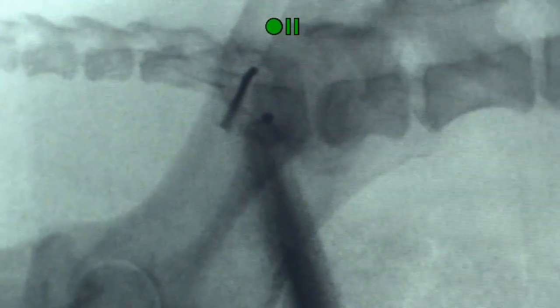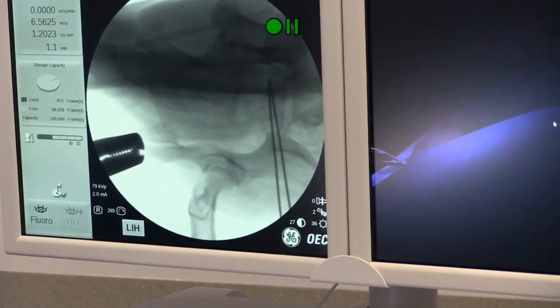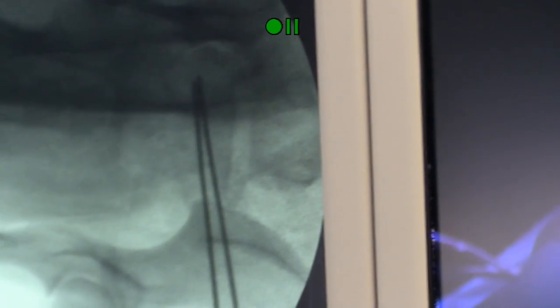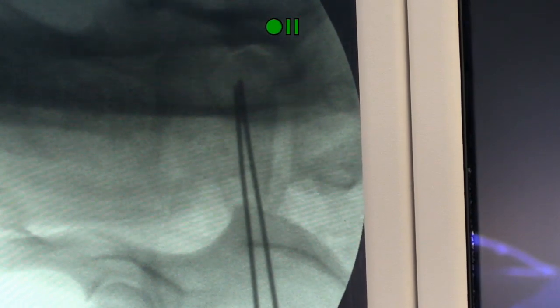So we'll do the orthogonal view now and check to make sure that the positioning is what we think it is. That looks pretty nice there. The reduction of the pelvis looks good.